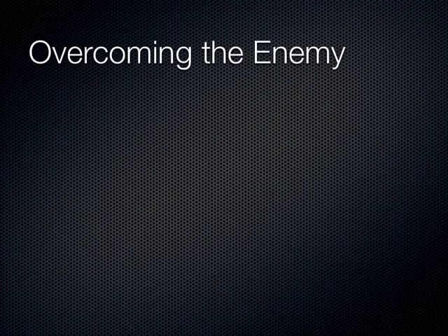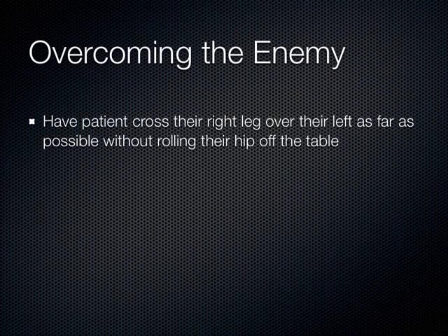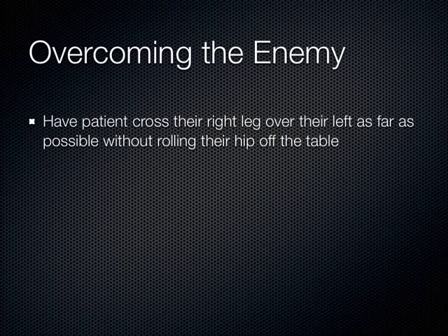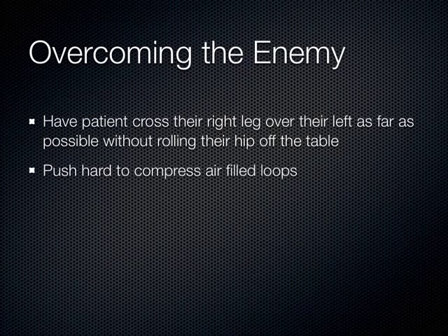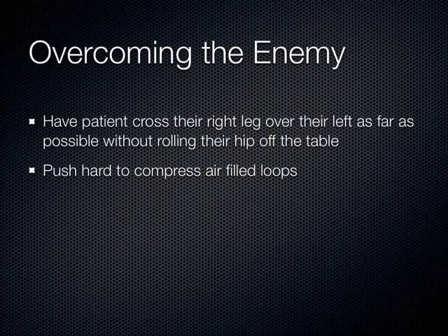To overcome the enemy of bowel gas, have the patient take their right leg and put it over their left leg as far as possible without falling off the table. That helps to compartmentalize the intestines more anteriorly so when you go to compress, you get a better angle. They don't slip out of the way as much. It's a tip a sonographer once taught me and it seems to help.